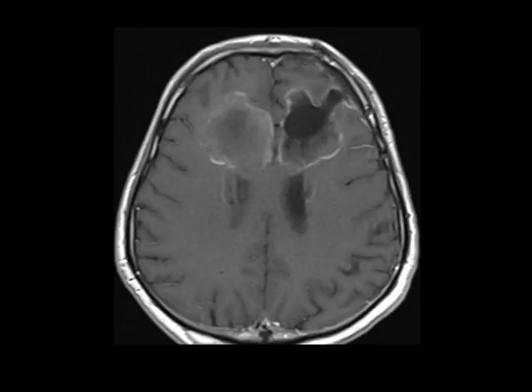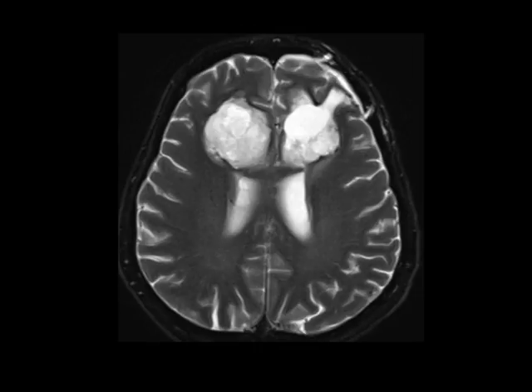These images demonstrate a T1 iso-intense, T2 hyper-intense, peripherally-enhancing mass with central necrosis, which courses along the genu of the corpus callosum. On susceptibility-weighted imaging, we also see that there is decreased signal along the margins, which is compatible with hemosiderin.